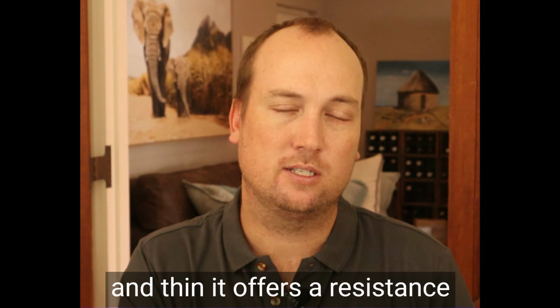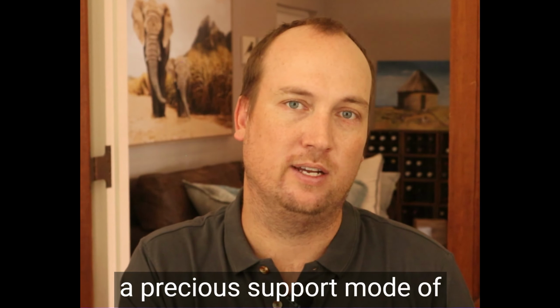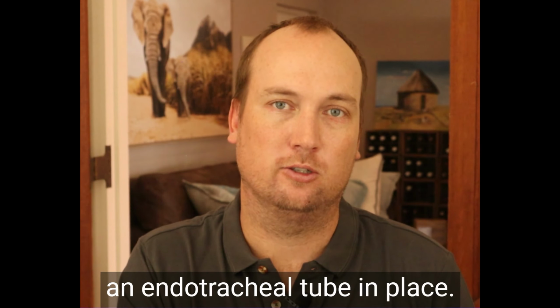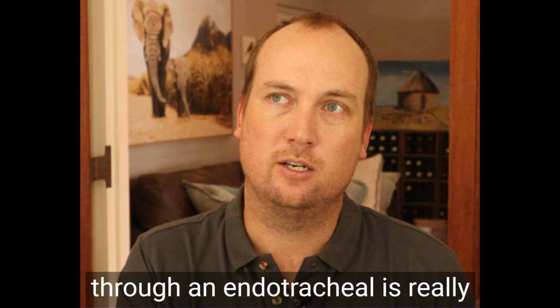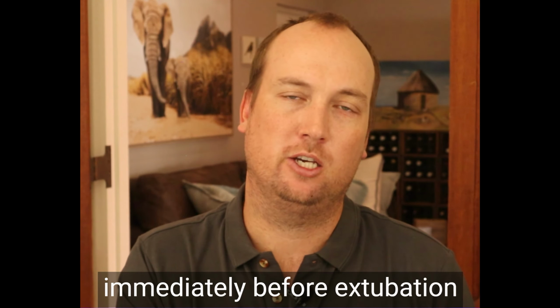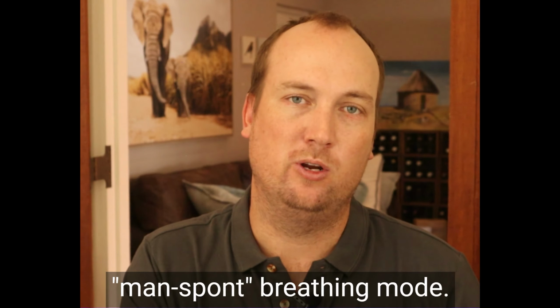It offers a resistance to the patient's inspiratory efforts, and so I always have a pressure support mode of ventilation as my minimum ventilatory mode when there's an endotracheal tube in place. So perhaps the only time when I would have a patient breathing spontaneously through an endotracheal tube is really immediately before extubation, when I turn the ventilator off and I put the patient onto a man-spont breathing mode.